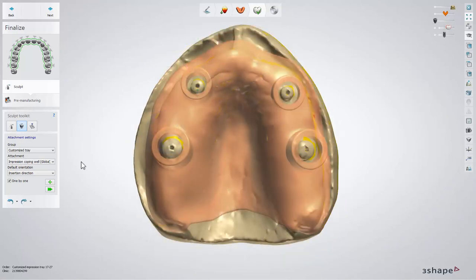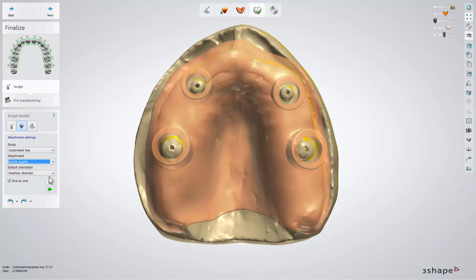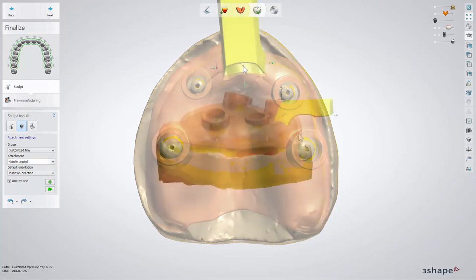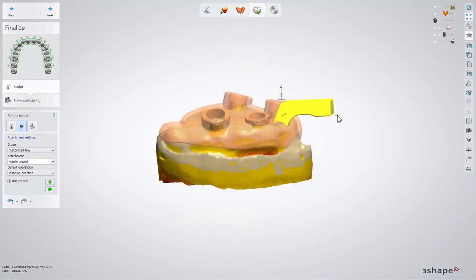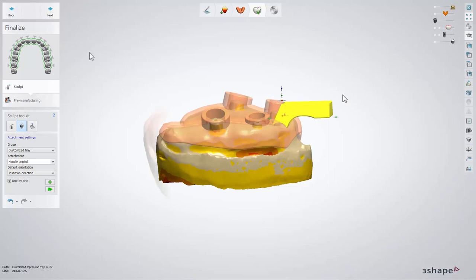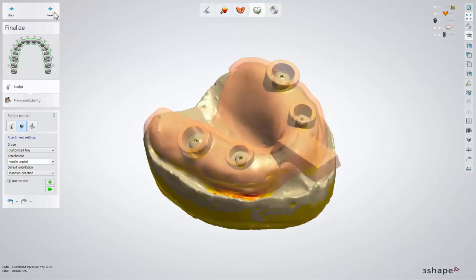Now you can add a handle, which will be used while inserting or removing the impression tray into or from the patient's mouth. To do that, choose the type of handle you wish to add. In our example we will use Handle Angled. Place the chosen handle and modify its position and shape. Select any of the control points to tilt the handle or to make it wider, smaller, higher, etc. When this is done, click Next.